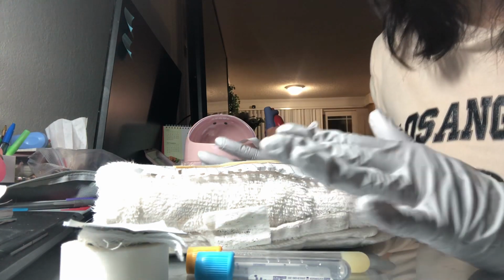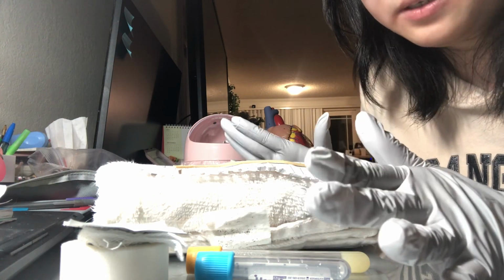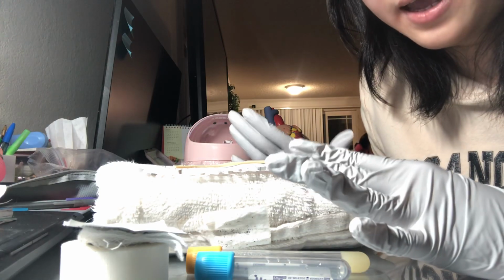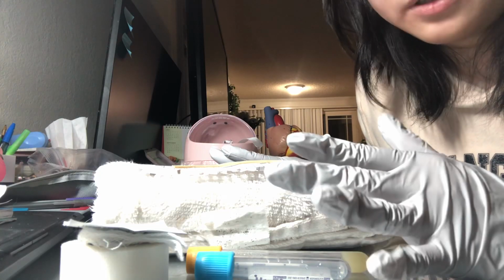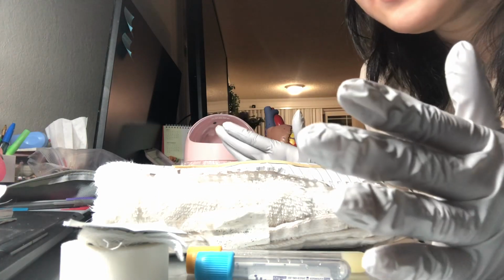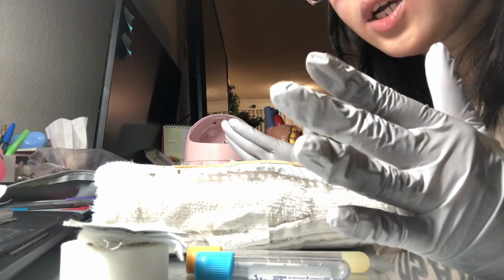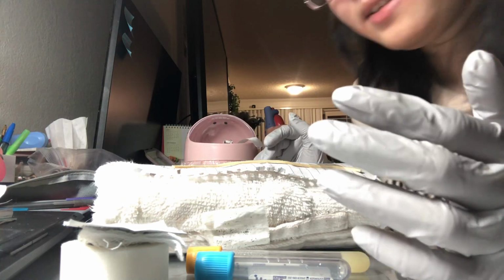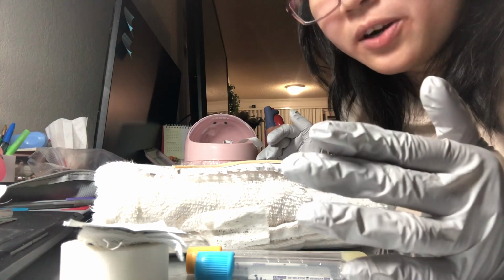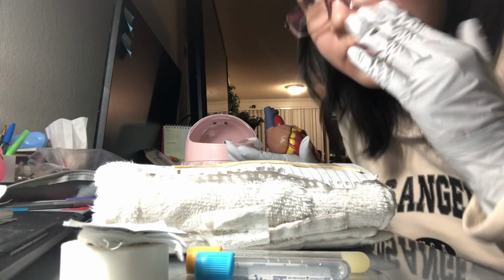So after the patient identification process has been done, I will go ahead and ask a series of questions for pre-collection inquiry. I will ask, when was the last time you had anything to eat or drink except water? The second question, are you on any blood thinners like aspirin or warfarin, Coumadin?